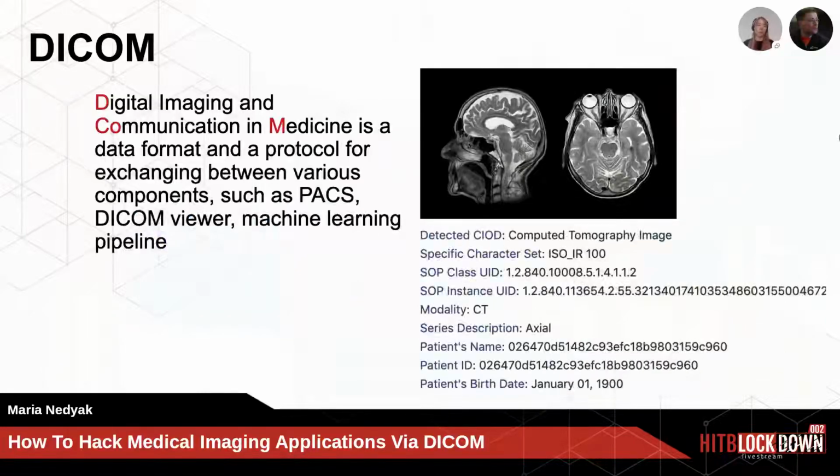And what is DICOM? DICOM stands for Digital Imaging and Communication in Medicine. It is a data format and protocol for exchanging data between various components. Generally speaking, DICOM has two parts: a file format of a medical scan, which describes how scan information is stored in a file, and a network protocol, which describes communication between two devices for transferring a DICOM file. At the beginning, I will speak about the DICOM file format and how it is connected with medical imaging, and then I will tell about the network protocol a little.